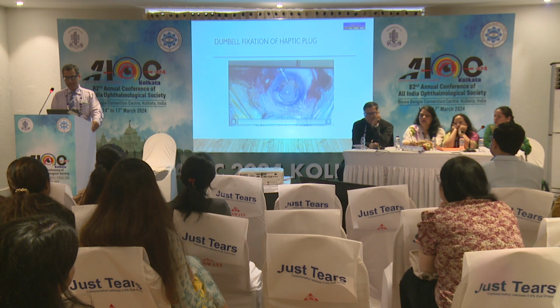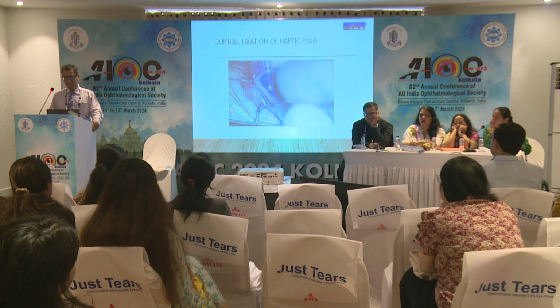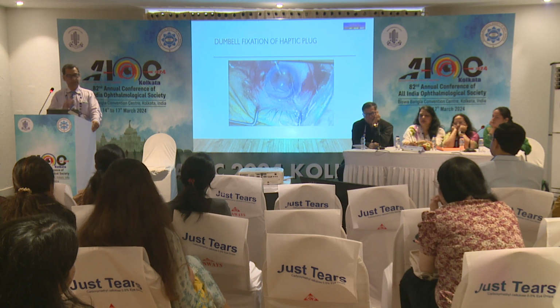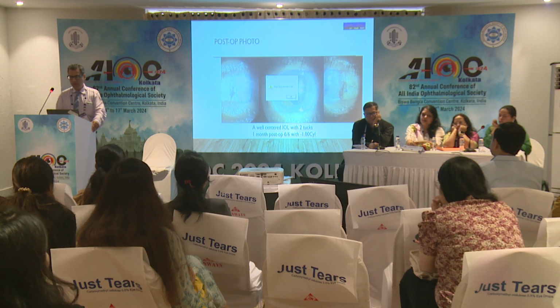So the other side you can similarly do that. Usually I use an AC maintainer or a vitreous infusion, and then you can further create the dumbbell and push it inside the scleral tunnel which you have created. So this is how it looks post-operatively.